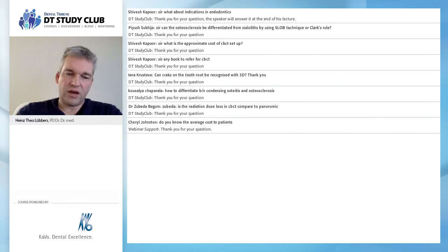But again, you can do a half panoramic, for example, and reduce it on that side. But you always have to take into account what is the resolution you use and what is the field of view, what type of machine. So you can't really say it's that simple, but probably in 10 years the answer to this last question would be a yes. But as we said before about prognosis in the future, I don't know.